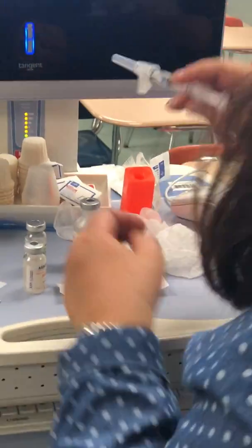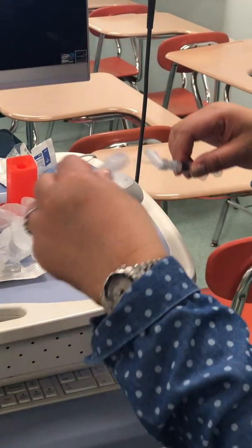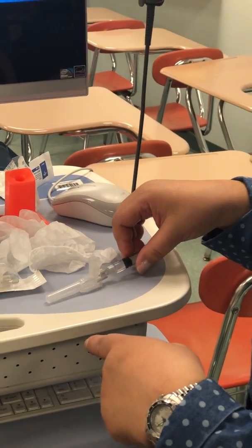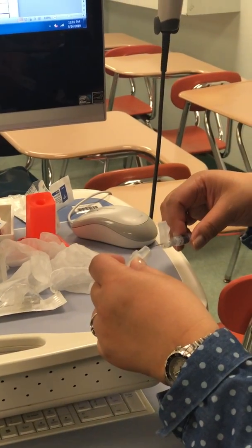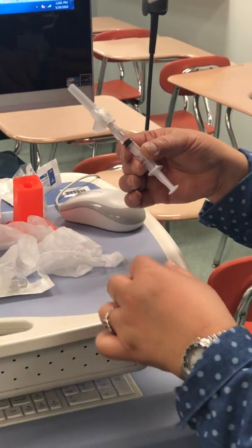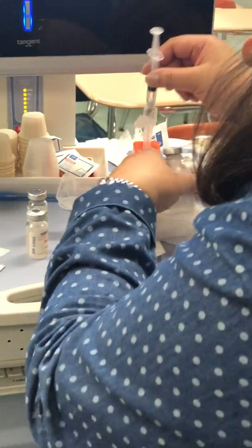If you don't have this, the best way to recap, because you haven't used this technically, you put your cap over here, and then you scoop the cup, and we go like this. You scoop it. Do not, because I saw somebody going like this. Do not go like that. That's how you get poked. All right. So we go like this, and we will do our third check.